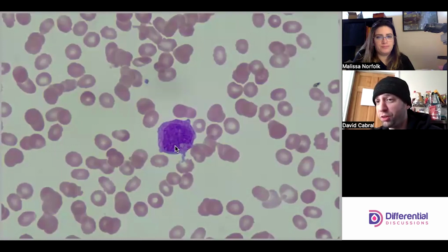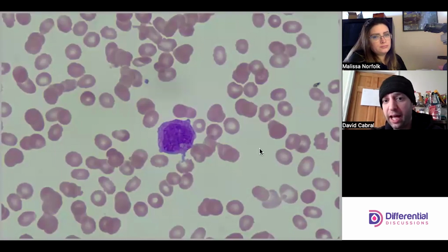Full disclosure, this looks to be a series of slides that Melissa has. We looked at the presentation day slide, and there's a lot of problems with the smear itself. It's just a bad slide. But what might happen once on presentation they discover a person has APL is they're going to give them a very particular drug, aren't they, Melissa? And don't you think that can affect maybe what we're seeing here and the maturity of this particular cell?